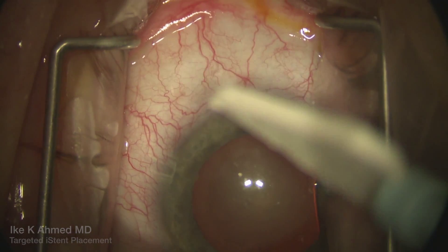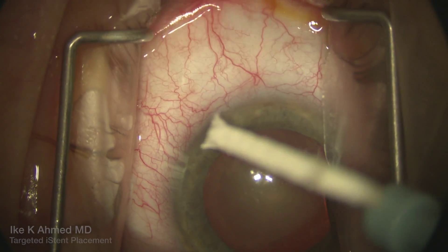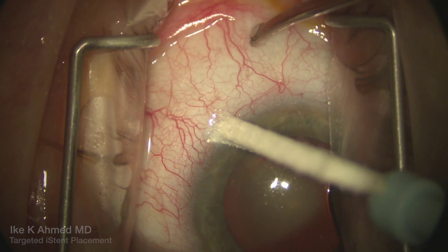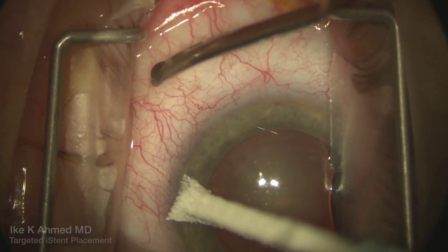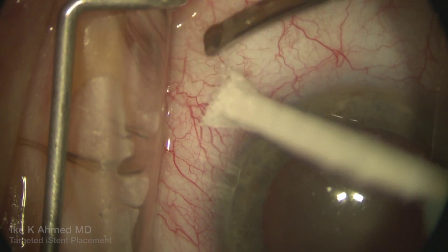This video demonstrates some of the superficial distal outflow veins and plexus that are present with conventional outflow and surgical augmentation with the iStent.